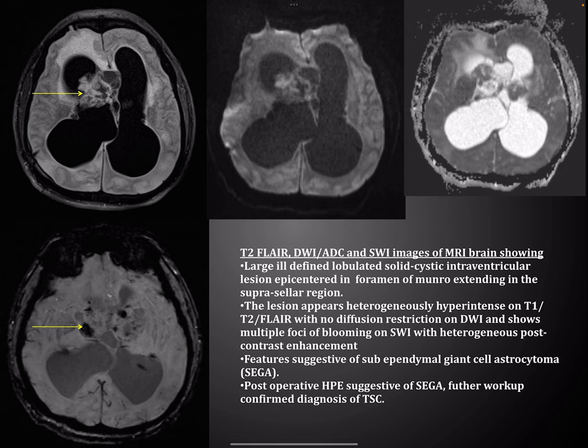Here is a case showing T2 FLAIR, diffusion weighted imaging and susceptibility weighted axial images of brain, demonstrating a large ill-defined lobulated solid-cystic intraventricular lesion at the foramen of Monro extending into the suprasellar region. The lesion appears heterogeneously hyperintense on T1 and T2 FLAIR with no diffusion restriction and shows multiple foci of blooming on susceptibility weighted imaging with heterogeneous post-contrast enhancement. Features suggest subependymal giant cell astrocytoma — SEGA. Post-operative HPE confirmed SEGA and further workup confirmed diagnosis of TSC.